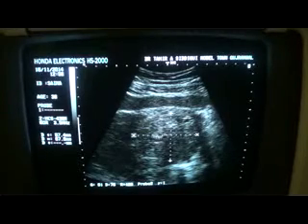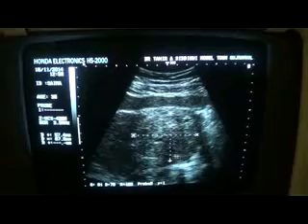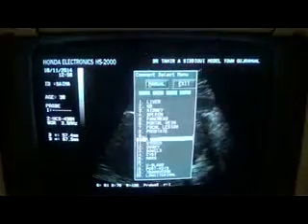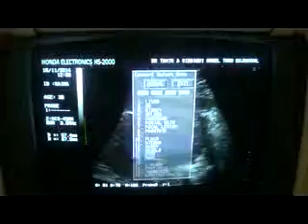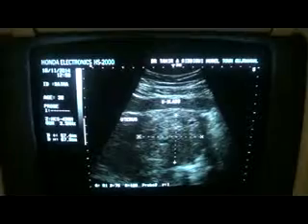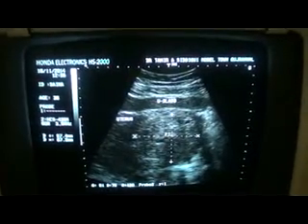You can see this is a cystic area, this is a cystic area. Similarly, these are a few other cystic areas within it. And this is the uterus. Anteriorly is the urinary bladder. And this we are seeing in the transverse section. And this is the fibroid with areas of internal degeneration, necrosis.